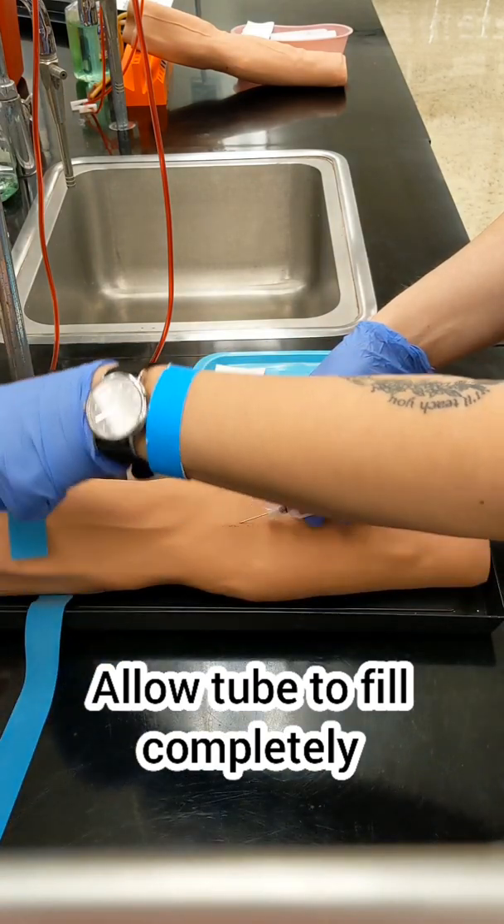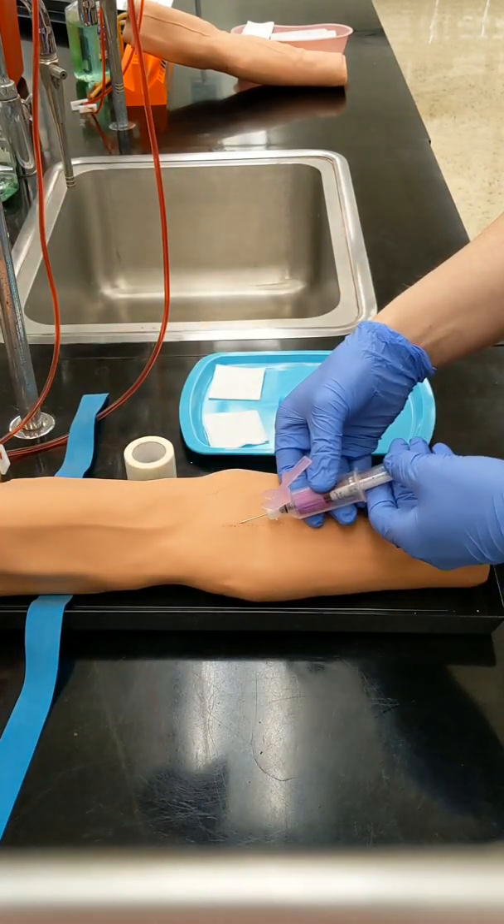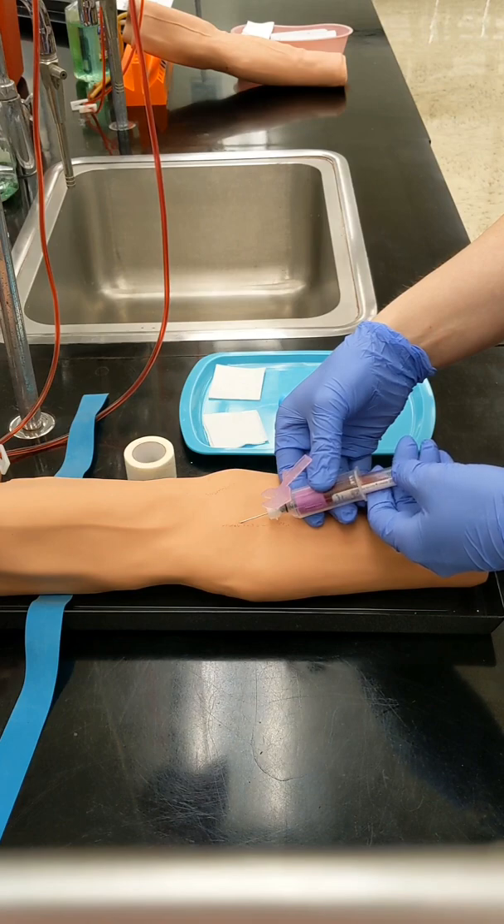When your last tube is halfway full, remove the tourniquet. Wait for the tube to fill completely before removing it.